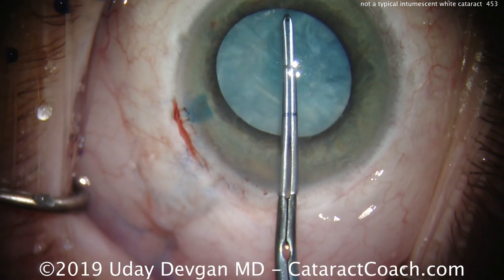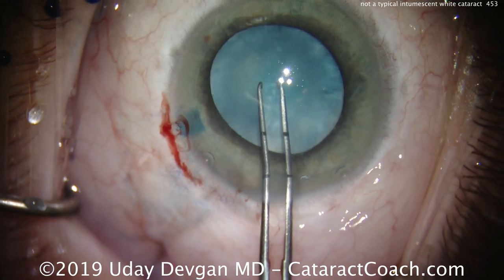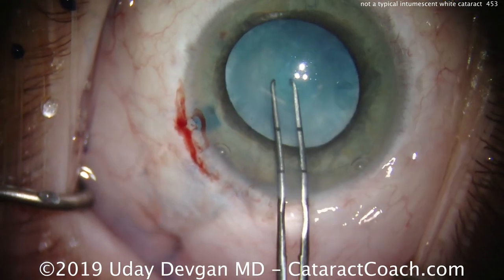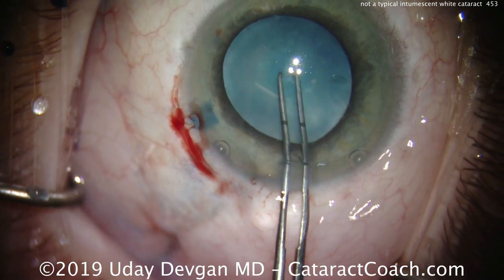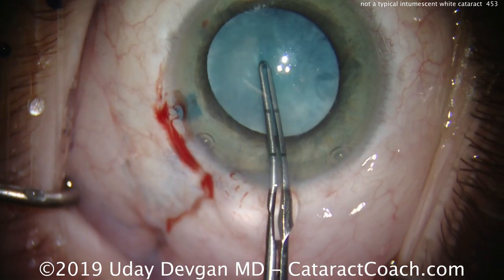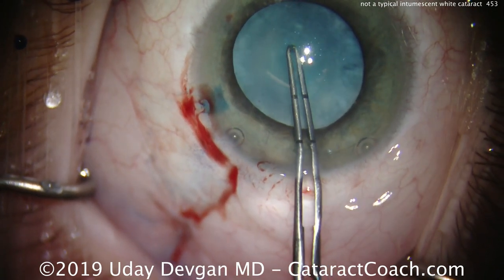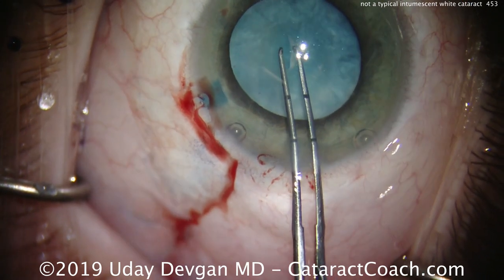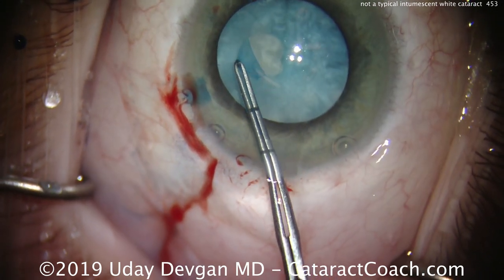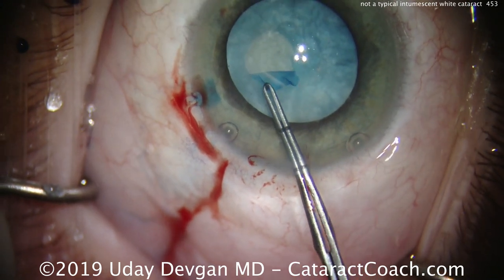Watch carefully — I'll put the forceps in the eye, measuring out my ideal five millimeters, and when I poke down on the anterior lens capsule, it sinks. It sinks inward. This is not a bulging forward anterior lens capsule; this is the opposite. It's concave — as I push on the lens capsule, it depresses. The pressure in the capsular bag is zero. There is no pressure in it. That's an unusual thing for an intumescent white cataract.